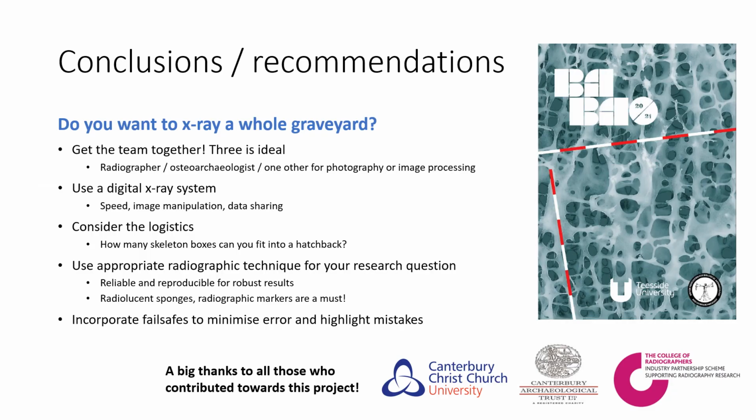Right, now conclusions, now recommendations from this project. Do you want to x-ray a whole graveyard like we did, assuming that you have a good research goal or question in mind? Get the team together. Three we say is ideal: a radiographer, an osteoarchaeologist, or someone with good knowledge of bones, and one other for photography, image processing, or as a runner.